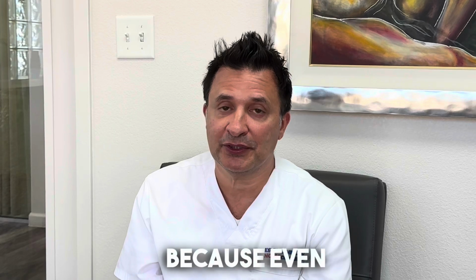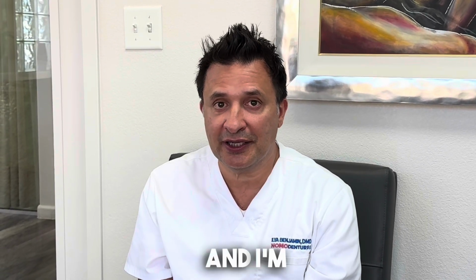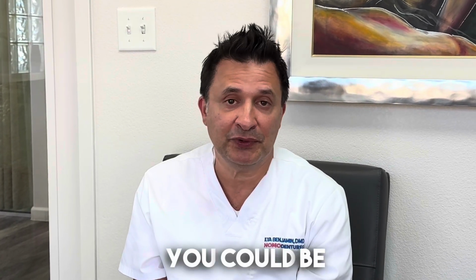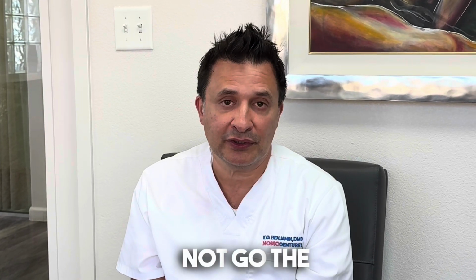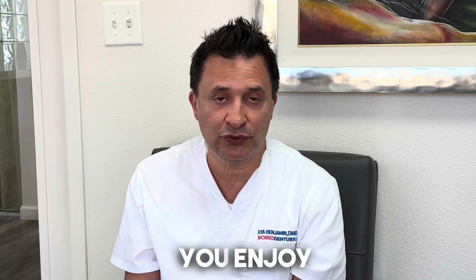Today's case was a little bit of a surprise because even though we used the surgical guide from the software, we had something that came to us at the end of the surgery, and I'm going to share with you how we solved it. So our point to you is sometimes you could be ready for things in life, but it may not go the way you plan it, but at the end you have to have the skill set to solve all the equations, and I hope you enjoy this.